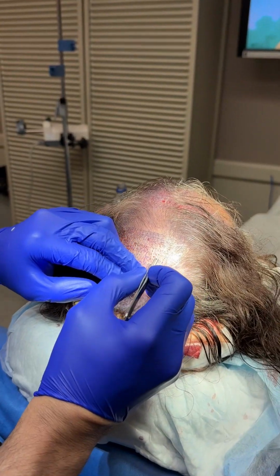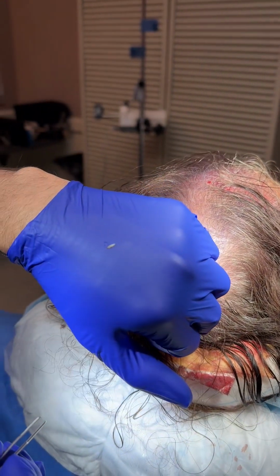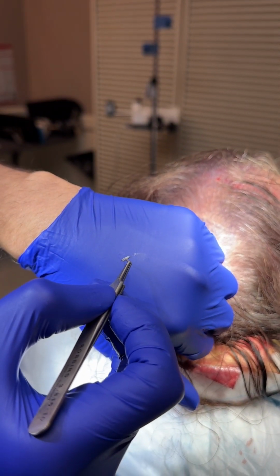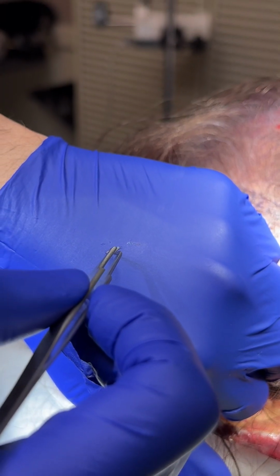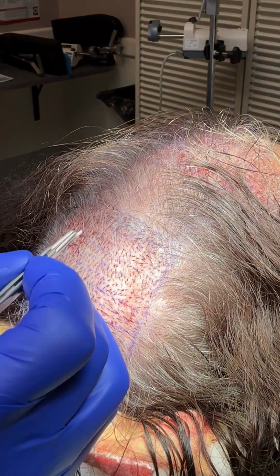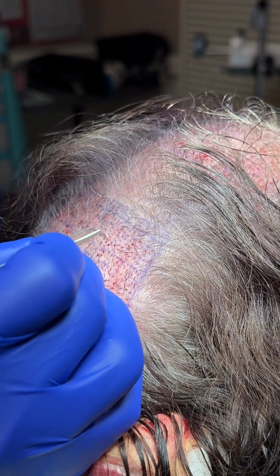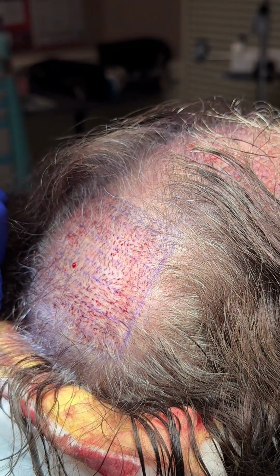All right, friends, right now we are doing our implantation. These are our recipient sites. This is the follicle, and this is an example of a single hair follicle. You can see there's a follicular unit here with a single hair going through it. We gently take this with special tongs, and we put this into our recipient site. Just like that, and it's going to grow in there beautifully.